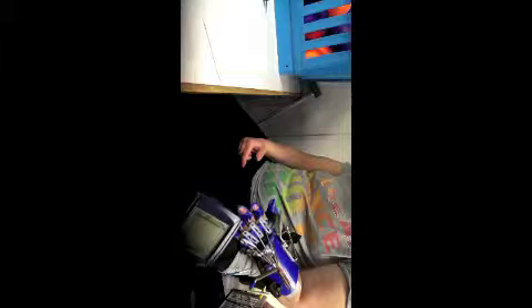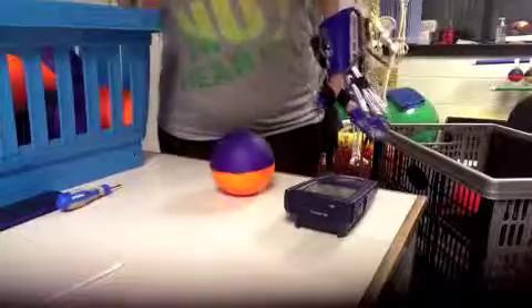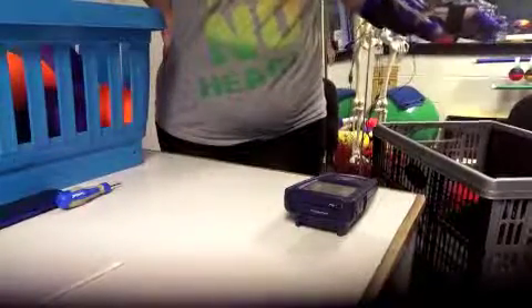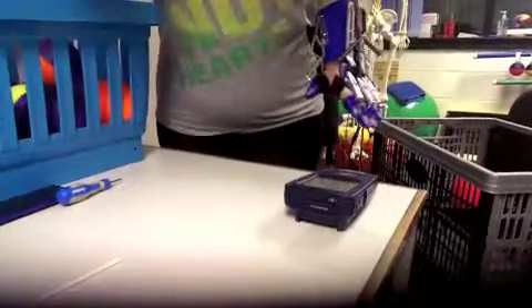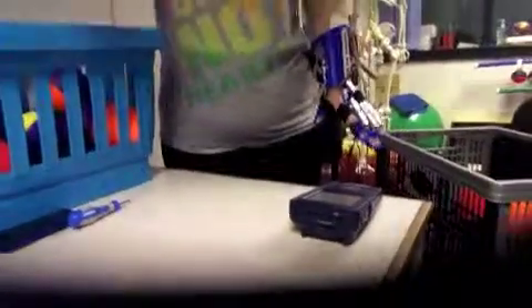When it says 'work', that means you've got a grasp of the ball, and once you go over the threshold, the e-stim kicks in. So we'll go into a game — big squeeze, good, relax, switch off, and then the e-stim kicks in. Here we are — we're going for a reciprocal EMG trigger. Squeeze — relax — and then you see the e-stim. Good, next ball. Come around, squeeze — there's the stim.